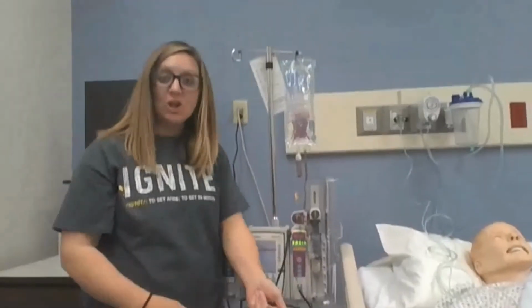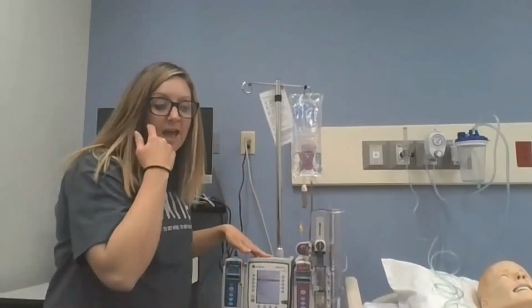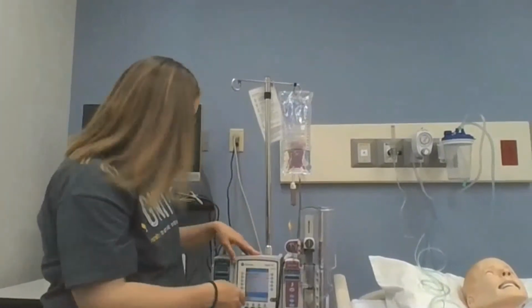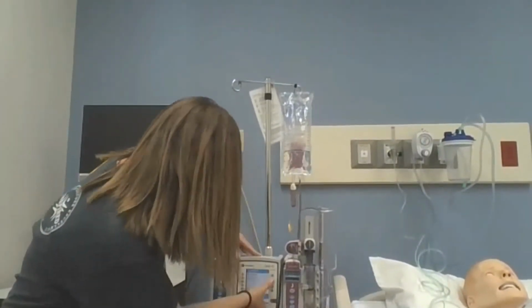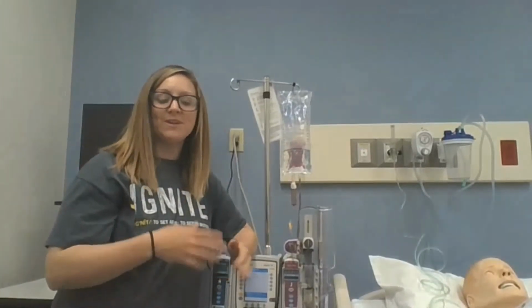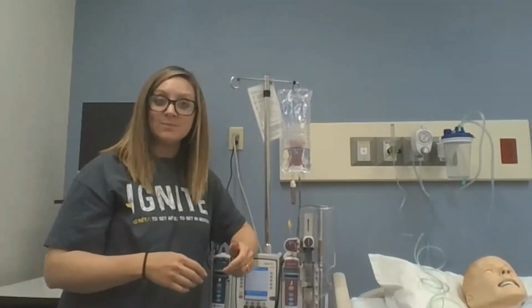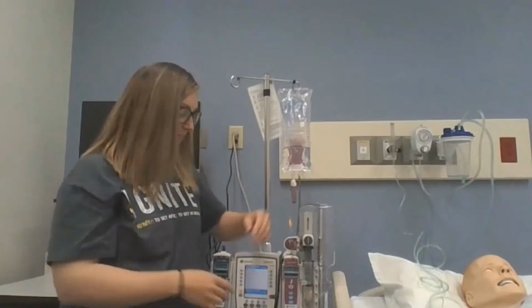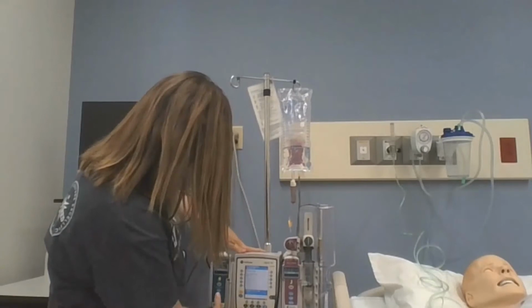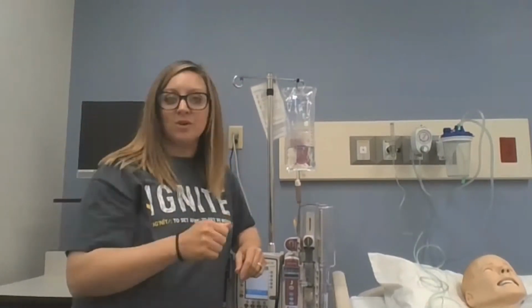It's also really important to note patient teaching with this. Patients that receive the narcotic sometimes are sleepy, and families are involved in most of these cases. And as with anyone, we want to make sure that our loved ones are taken care of, and we don't want them to fall asleep and wake up behind on their pain. We don't want them to be hurting. And so it's really tempting sometimes for family members to hit the button for patients and say, oh, I don't want them to get behind.